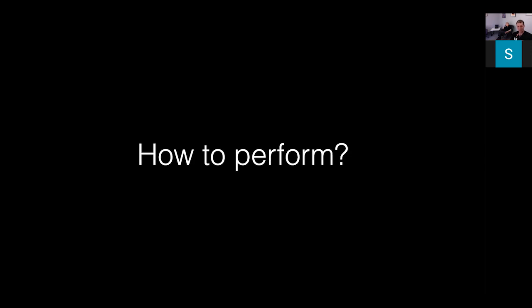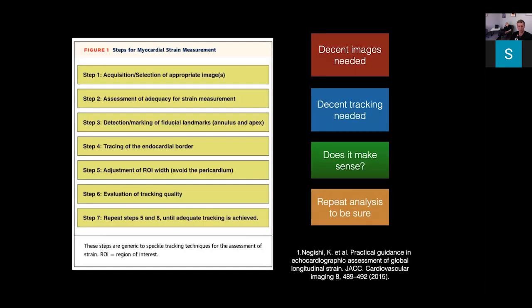All right, so how the hell do you do it? Well, the bottom line is it can be a little tricky, and it's not something that you need to give to your medical student to go away and analyze. I think if you want to do it, you've got to be pretty good at echo first of all. So there's a process that you should follow. Kaz Nagishi here is one of the leaders in doing this. He put out a beautiful paper describing how to do it.